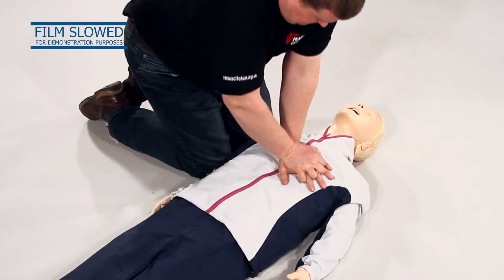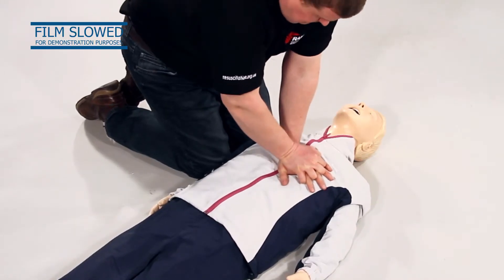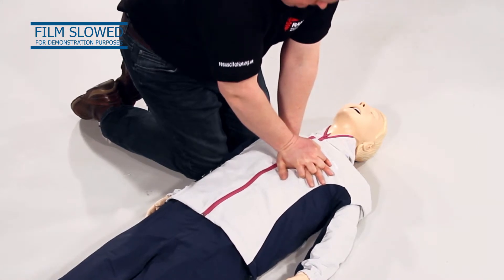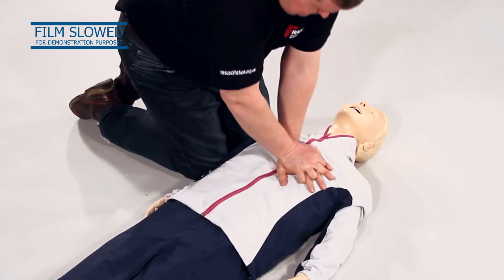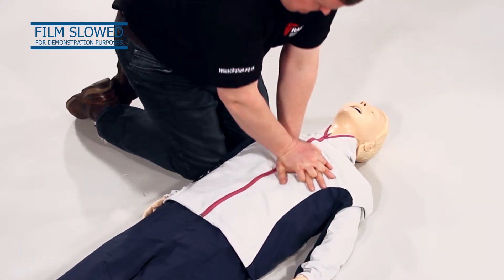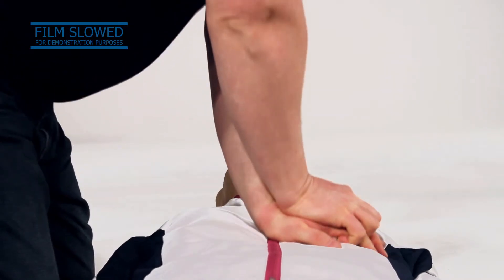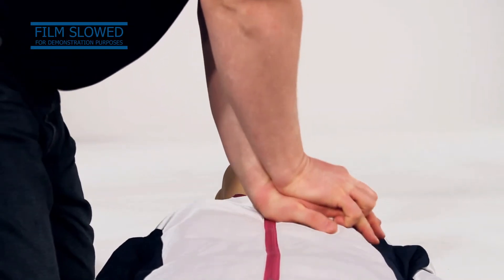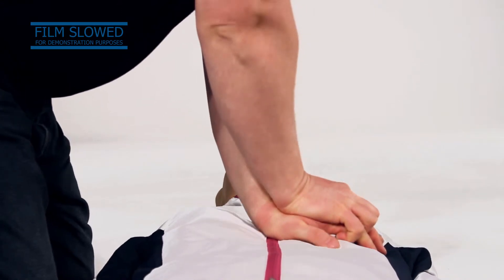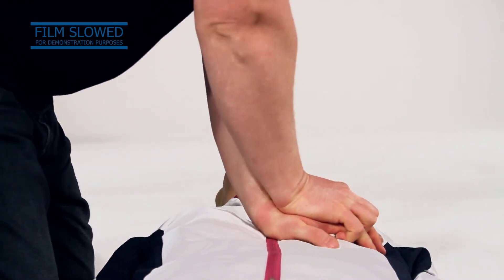After 30 compressions, give two rescue breaths. Different methods of delivering rescue breaths will be demonstrated later in this film. If you are not trained to or are unwilling to give rescue breaths, give chest compressions only. Continue CPR until professional help takes over or the AED arrives.